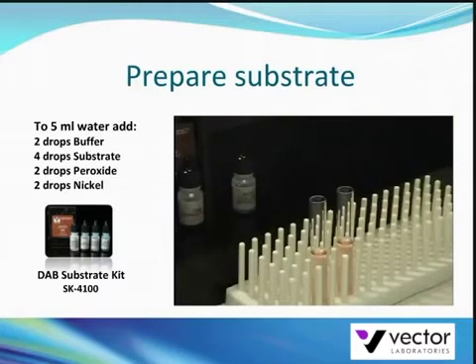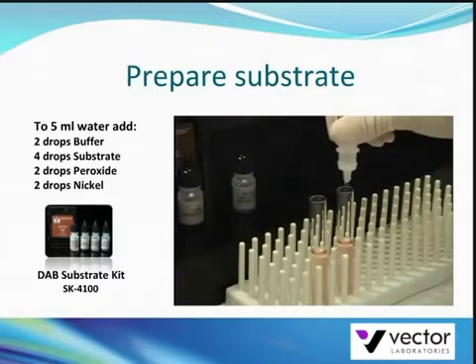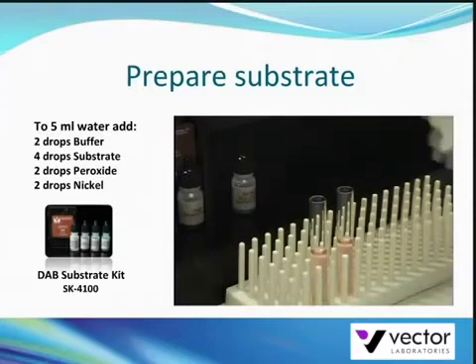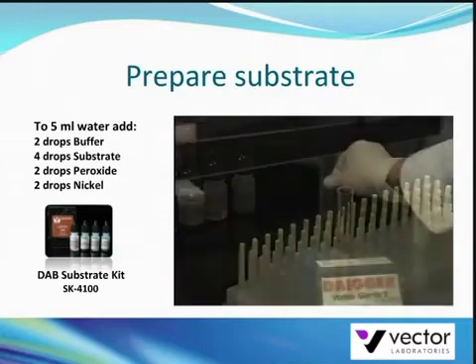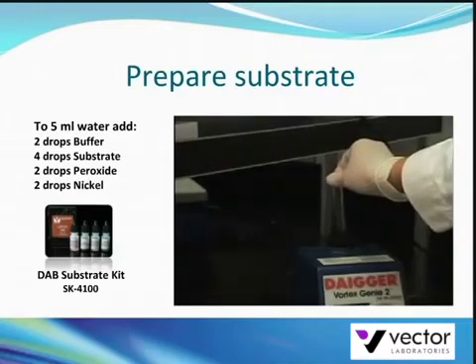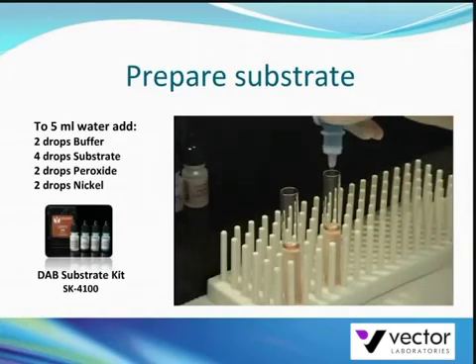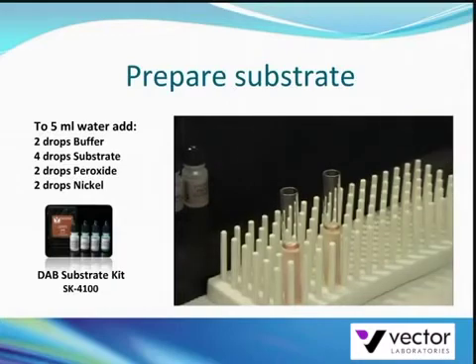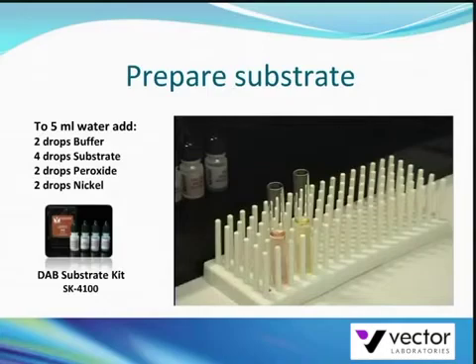Add 2 drops of the hydrogen peroxide solution and mix again. At this point the solution has a pinkish hue. If a grey-black stain rather than a brown stain is desired, add 2 drops of the nickel chloride solution. This working solution has a yellowish hue.